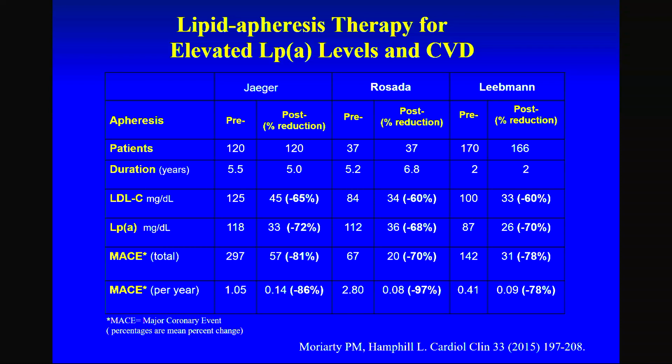Well, I'm proud to say Kaneka, with my help, has submitted a PMA to the FDA last month recommending treatment of Lp(a) with vascular disease and LDLs and Lp(a) greater than 60. We had a meeting with the FDA a couple times, and the meeting went extremely well, believe it or not. Their biggest fear was not the Lp(a) story.